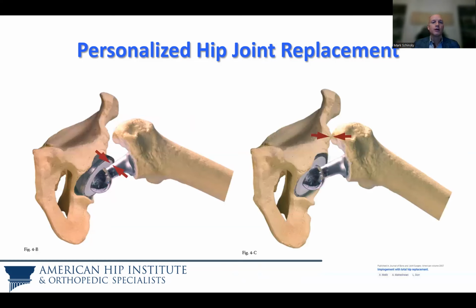As you've likely heard in other talks about femoral acetabular impingement in a native hip, you can also have impingement around a hip replacement. There are a couple forms of this. The implant can impinge on the implant itself. On the left, you can see where the femoral neck is impinging on the acetabular shell, or you can get bony impingement, as described here on the right, around hip arthroplasties.